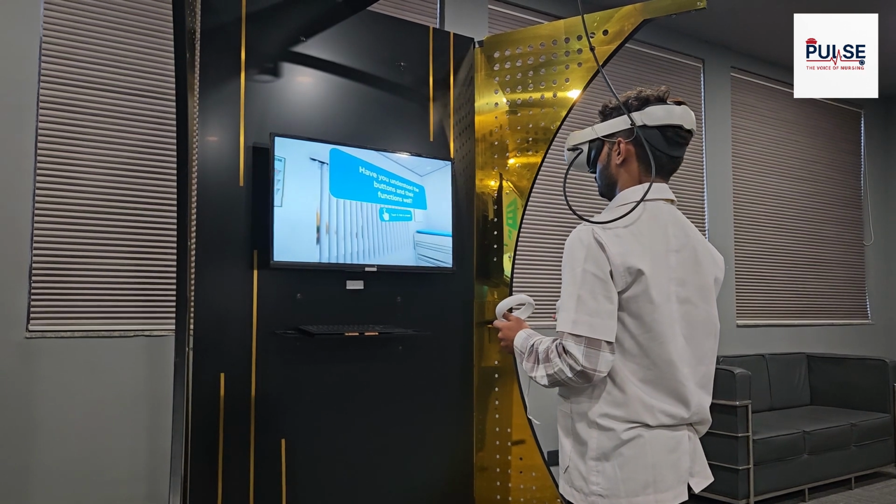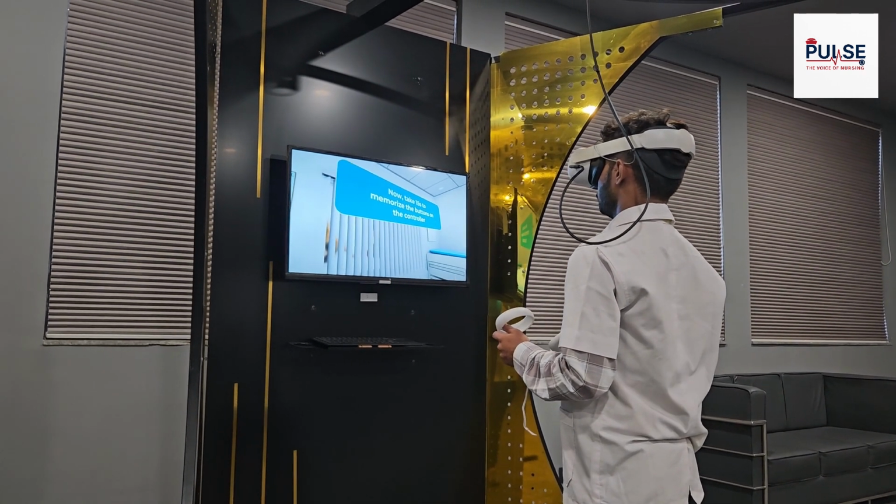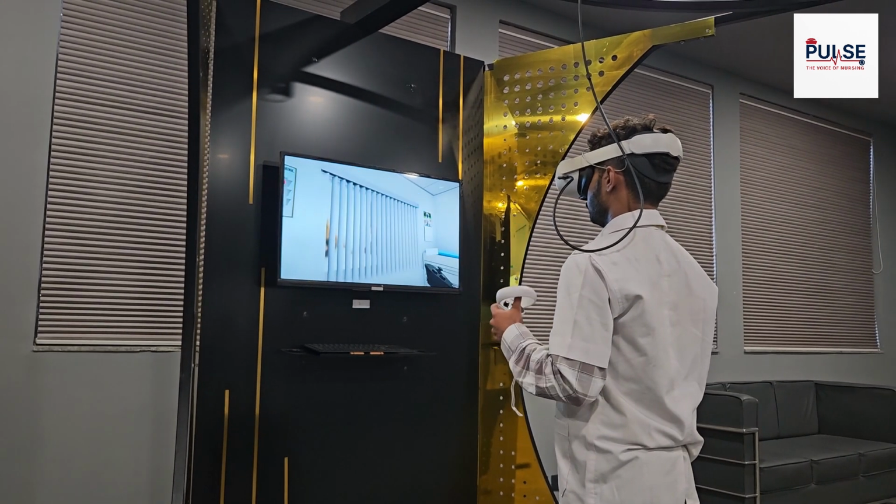Have you understood the buttons and their functions well? Now, take 15 seconds to memorize the buttons on the controller.